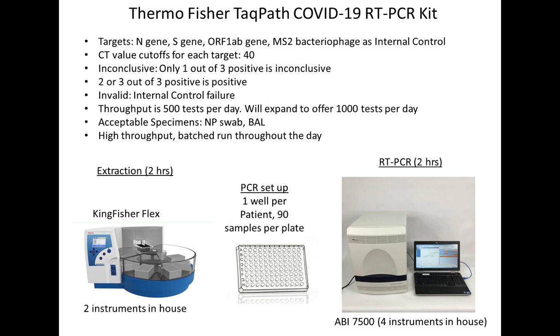So, I think a lot of us are in an unusual scenario, as discussed before, where we have a lot of different tests for these same specific analytes, right? If you look across the board at most clin micro labs, you aren't running, let's say, 3 different tests for HIV viral load. The reason you don't do that is tests have different sensitivities and specificities, and you don't want to end up having kind of a good test versus a not so good test and triaging patients.